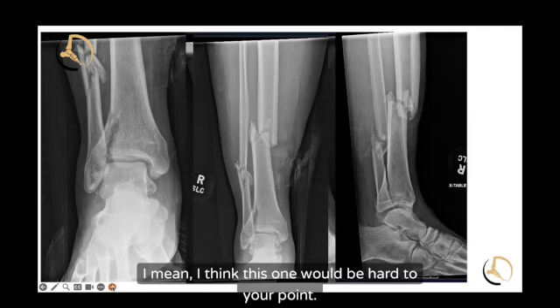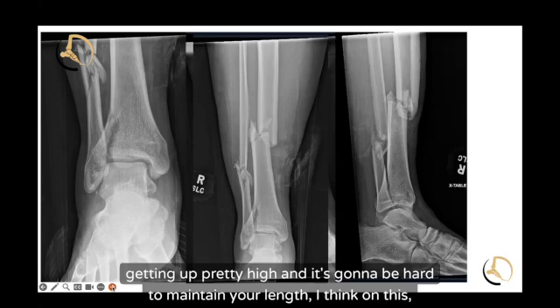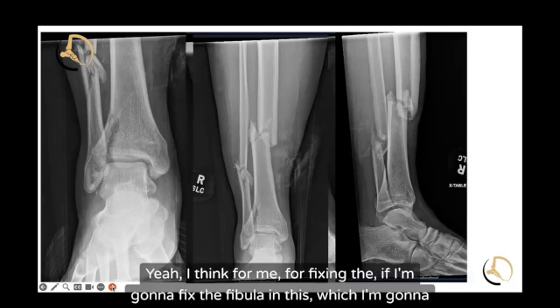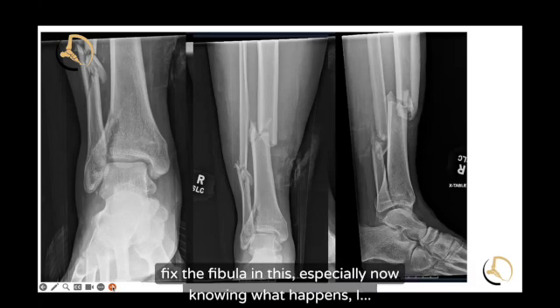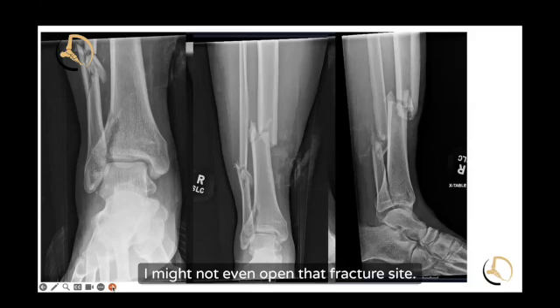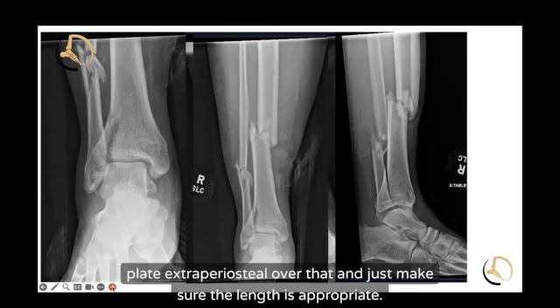If you looked at this and said you're going to use a fibular nail, it's getting up pretty high and it's going to be hard to maintain your length. If I'm going to fix the fibula on this — which I am — because of the comminution, I would probably bridge plate it. I might not even open that fracture site. I'd put a small incision distal, a small incision proximal, and slide the plate extraperiosteal over that, just making sure the length is appropriate.